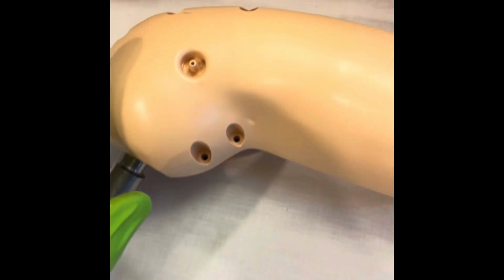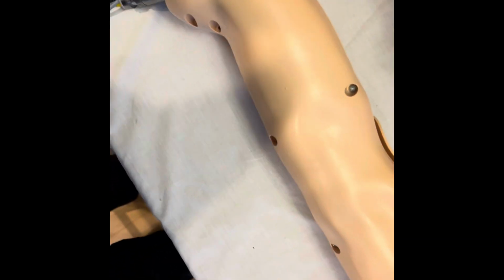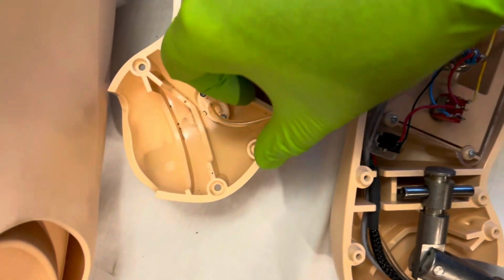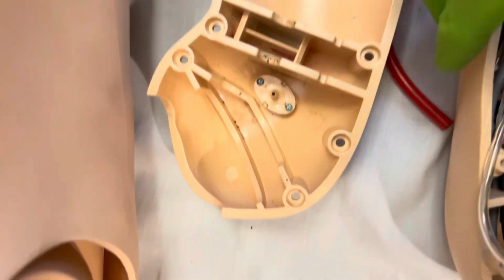Next thing we're going to do is take all the screws out from underneath here. There's 15 screws on the arm here, so go ahead and take those all the way out and then set them aside. Recommend pulling this hose out of the exit port. You might need a pair of needle nose pliers. Mine just came out, so I was able to pull it pretty easy, but pull that out completely to get it out of your way for the bottom cap.